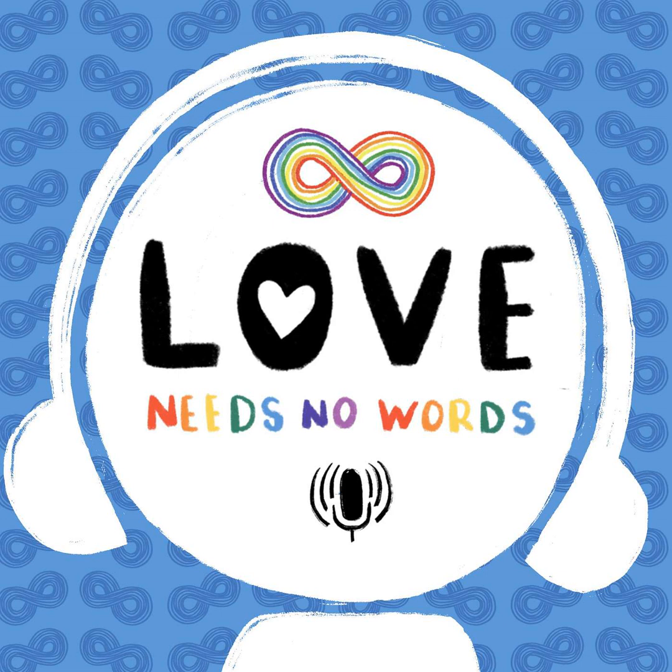So what we do is we put the AAC device on a separate device. We essentially turn an iPad into an AAC device. We download the app that works best, and we get a good fit. This is a good start for your child. And we put it on guided access. We lock it on for a young child, so they can't get on anything else and they can't go into YouTube and they can't take photos. And then we still give them plenty of access to their other device.